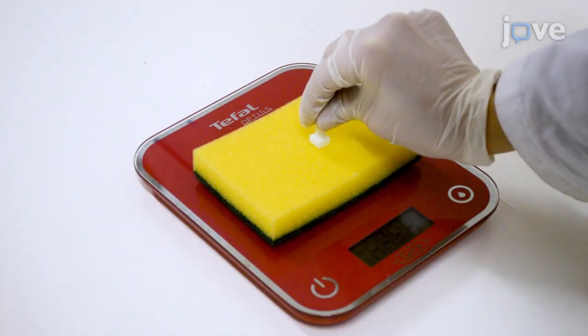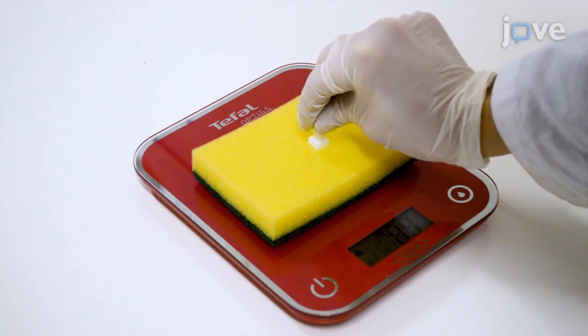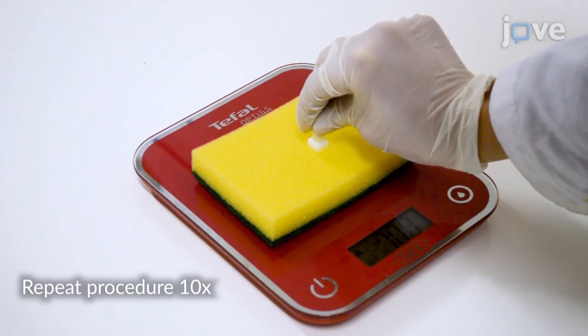Prior to the test, the experimenter must be trained to standardize the force applied on the subject's tongue. Take the tool and apply a force of 100g on a sponge placed on a scale.